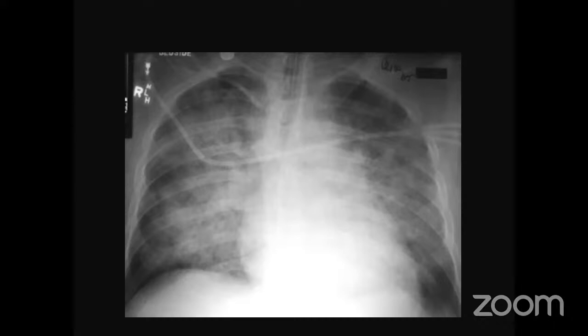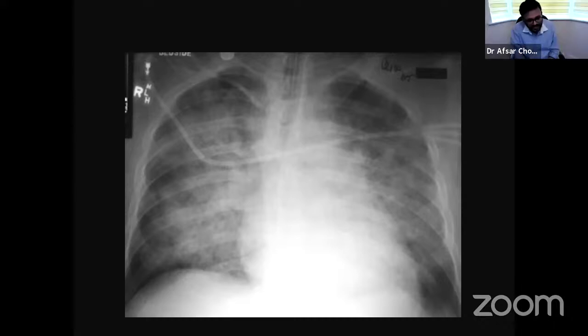You're losing valuable time. So again, what is your take on that? Yeah, no. If you're suspecting a mass, I don't think... See, the thing is, there are a lot of imperfections in X-ray. X-ray is a very primitive test, but still holds good because of the lot of good things it has.